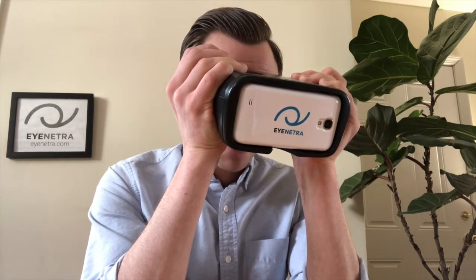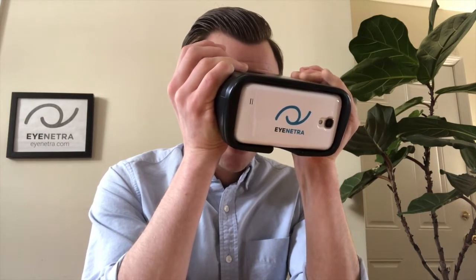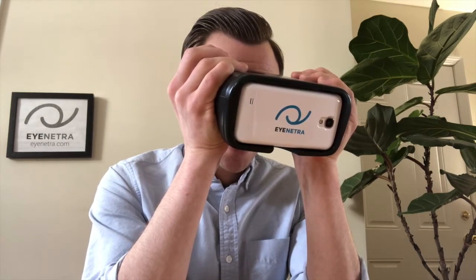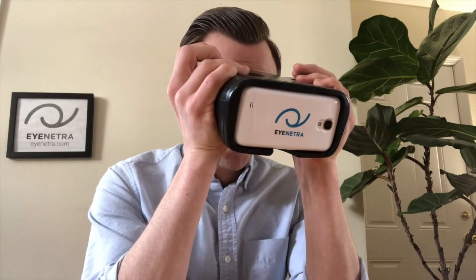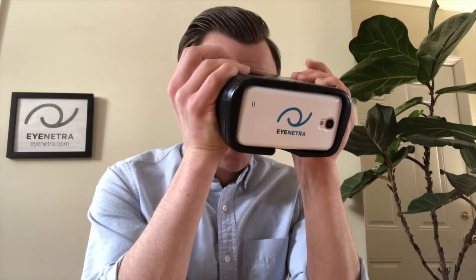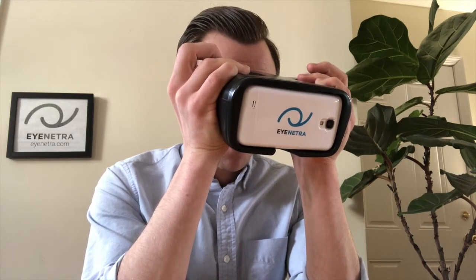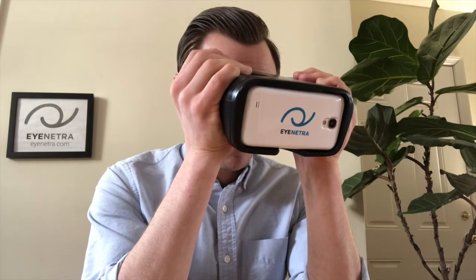Align with the left and click. We are three quarters of the way done — almost done. Last one. Great job, we're finished. Your measurements are ready. Please put down the Netra. Now inside, when I finish, I see a nice big blue check mark so your patients know when the test is finished. To view the results, simply remove the phone.